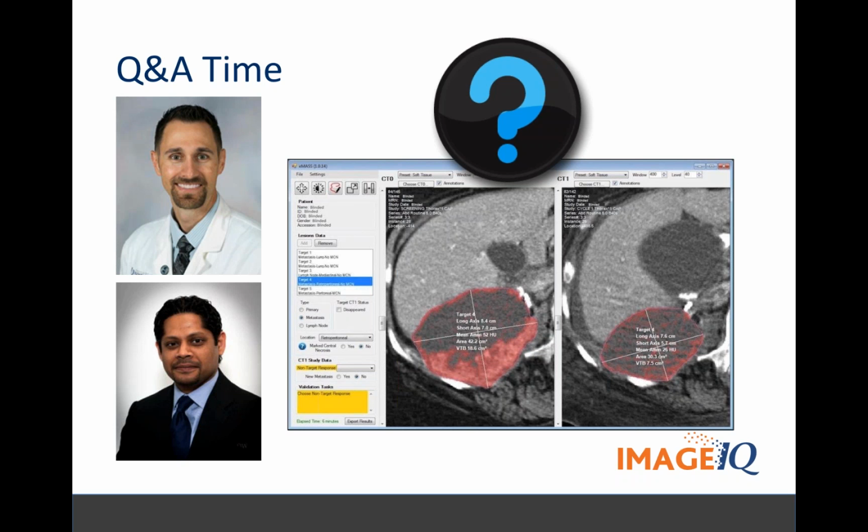Well, you could have someone locally do the reads, but you can also do what you guys have set up in ImageIQ, like an EDC: capture the images and have someone centrally provide that read. And that happens quickly. The software is amenable to that. So yes, you certainly can do real time. Not necessarily on the scanner, but as soon as it comes off the scanner and it's available digitally, the read can be done. Most people, when they say real time, are talking about 48 hours or 72 hours, but it could be done faster. It's all a matter of what the need of the trial is.